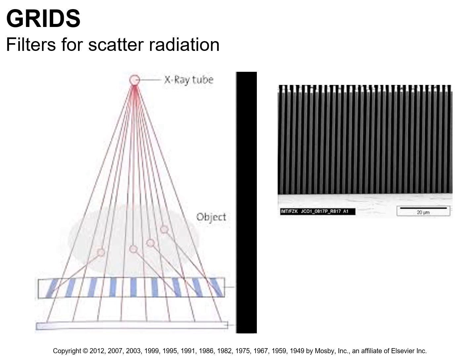But then there's a human body there, that oval shape, and some of the photons actually interact with the molecules and they produce a weaker photon that changes direction. That would be a scatter photon. The scatter photons that change direction, they don't actually convey any useful information to the image receptor.